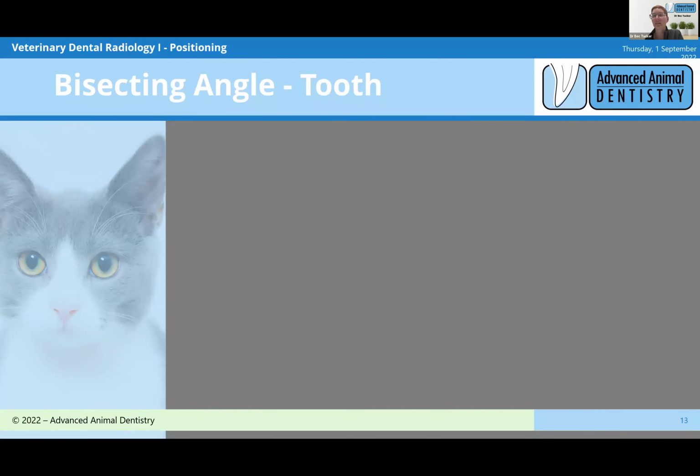And understanding the underlying fundamentals of it just allows you to adapt. To be honest, we basically use fairly set angles. For most patients it's going to be about this angle, and that's where I'm used to holding my x-ray generator, but we can also adapt it really quickly for the individual because we have that understanding. So if you do that, you'll probably find that you get a big improvement in the quality of the images and the ease of interpretation.